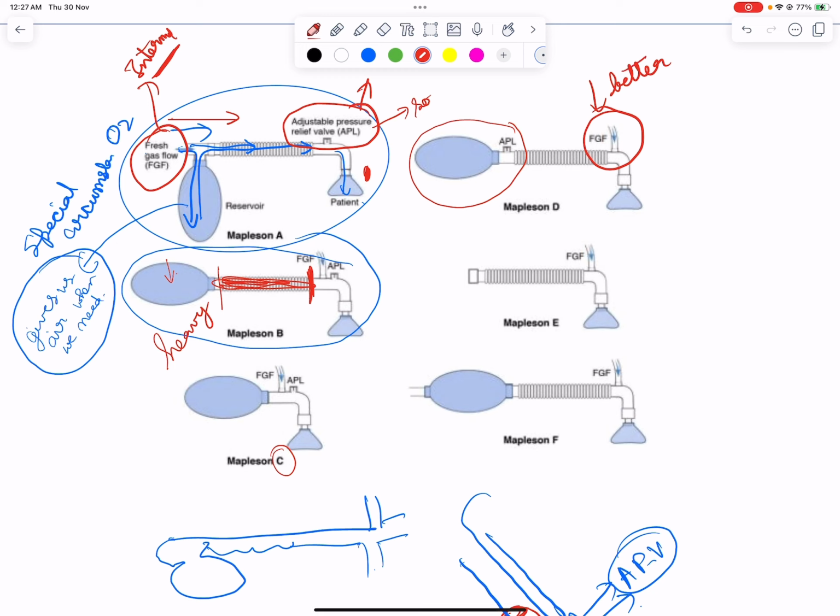Now, when it can be better regulated and the patient would be in better supply of oxygen, fluctuations have become very less. Earlier, for example, this would have been the fluctuation of oxygen, but now there is a continuous static supply.